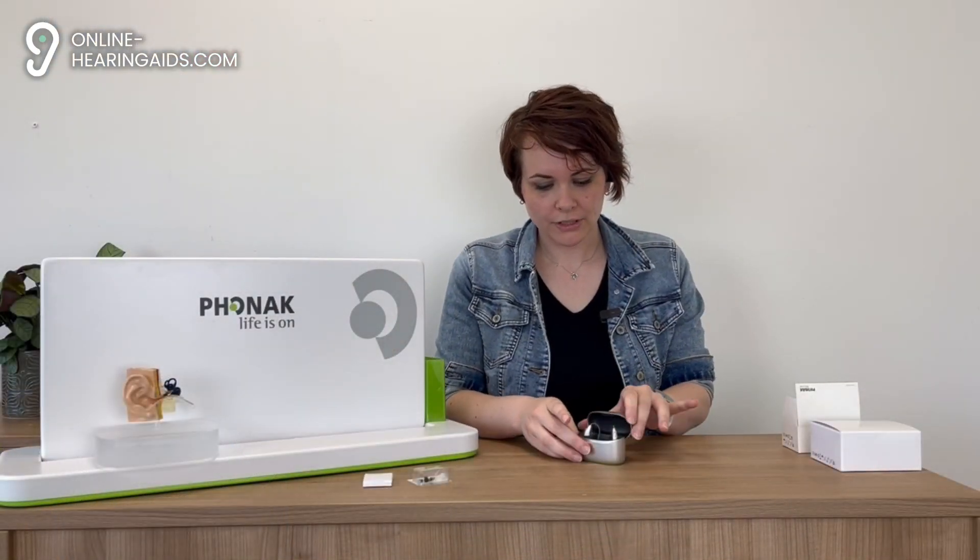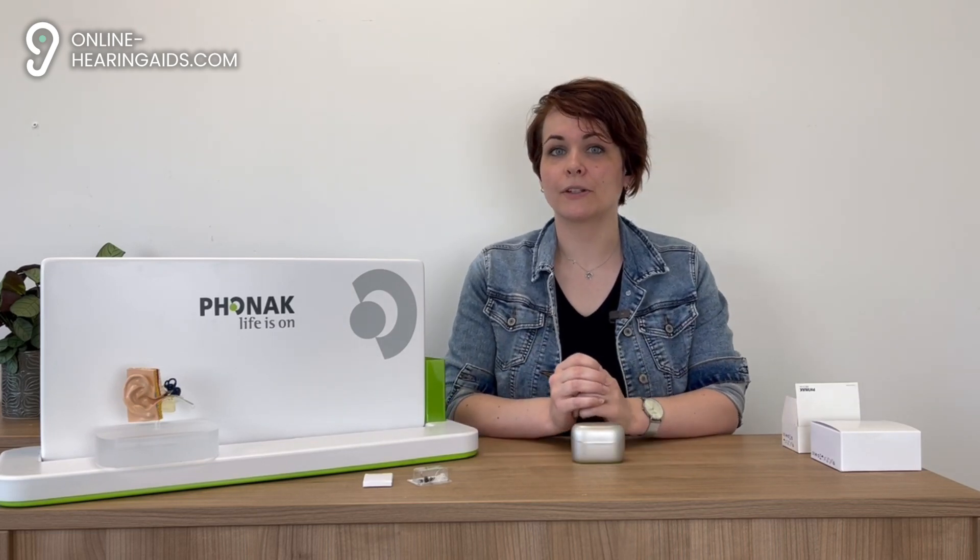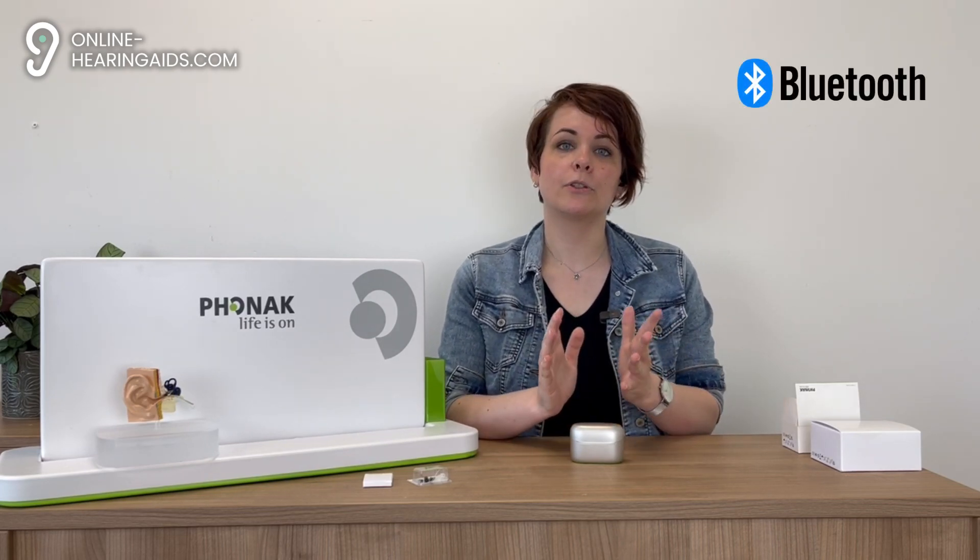The waterproofness is even better than the IP68 standard, which means you don't have to worry about any kind of rain or an unexpected splash of water. One of the features that stands out is its ability to connect to eight Bluetooth devices, and you can even keep two connected at the same time. This is perfect for people who want to frequently switch between a smartphone, tablet, or laptop for example.